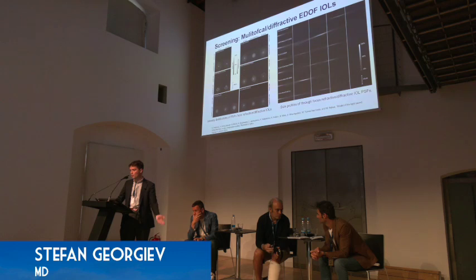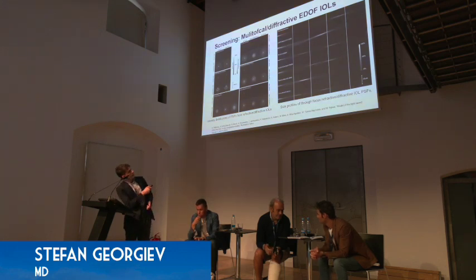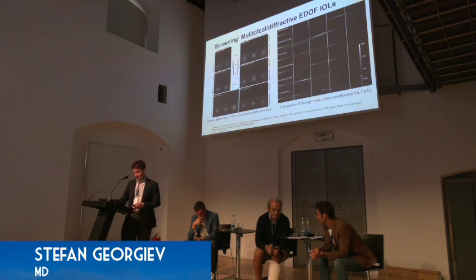So compared to a monofocal, you have many different focal points. Here on the left side, you see the point spread functions for far, near, and intermediate focus. And on the right side, you see a longitudinal scan, basically, where this will be the retinal image intensity at 0 diopters, and then at 1, 2, 3, depending on lens design, of course.